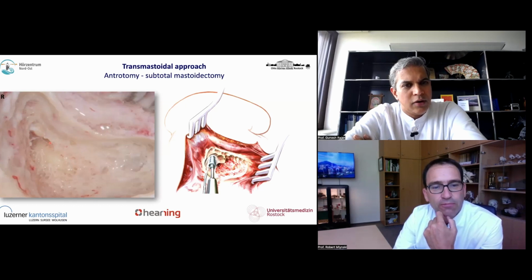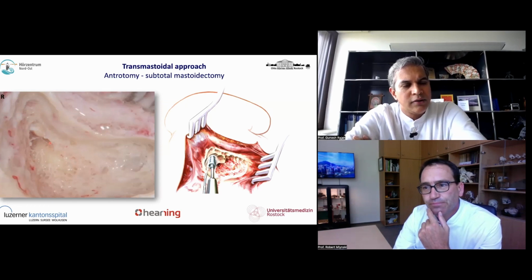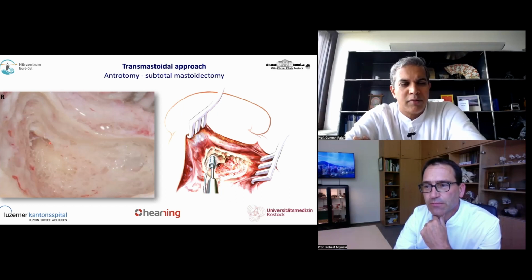Do you also use facial nerve monitoring? We always use it. Is that the same with you guys? No, we use it only in malformations. Okay, otherwise not routinely. We tend to use it because we have people in training, to have that extra monitoring.